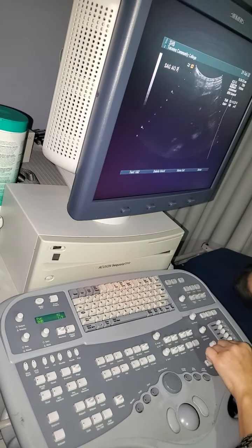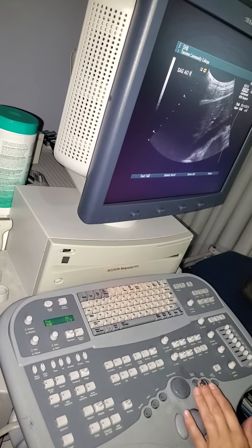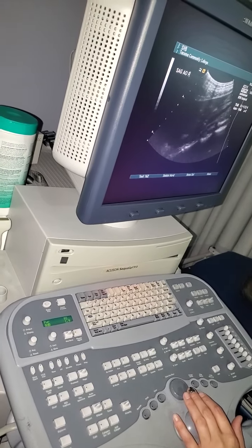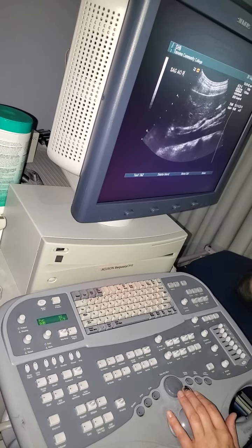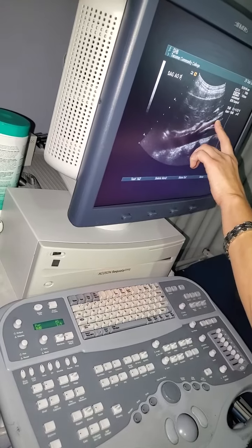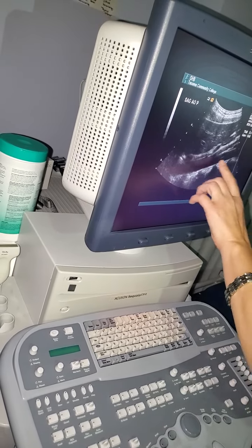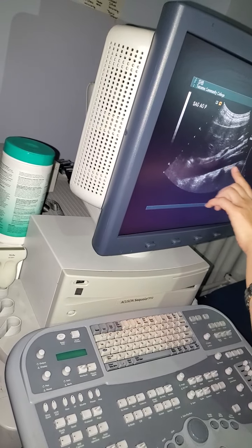Okay, so we went through 2D, TGCs. So if I'm ready, go ahead, big breath in and hold it. So here we are, there's our aorta. Look at how nice that is. What is this right here? SMA? SMA, so go ahead and breathe. So aorta right here, and we'll learn this next week. I'm just getting a little squirrely because it's so beautiful.